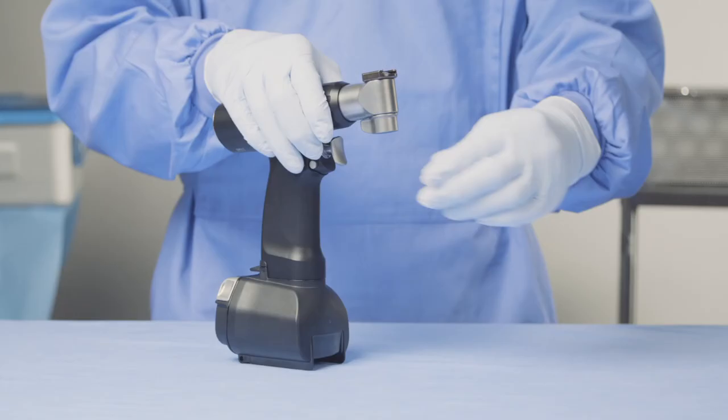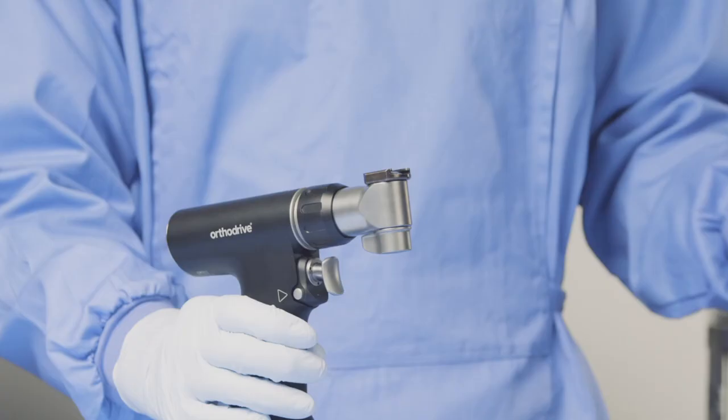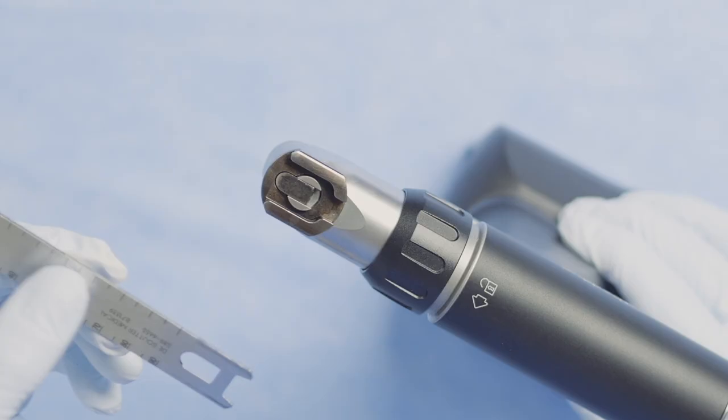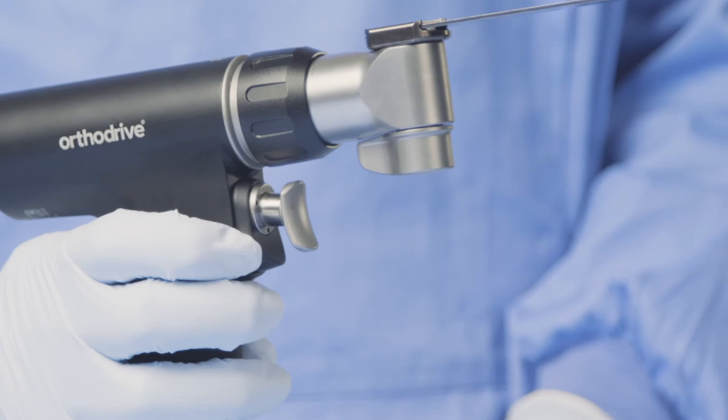Before loading a blade, make sure your tool is in safe mode. This is an S89 sagittal saw blade, and it can be pushed into place with a simple push and click, like so. I can then push the mode selector to either side to run the saw.